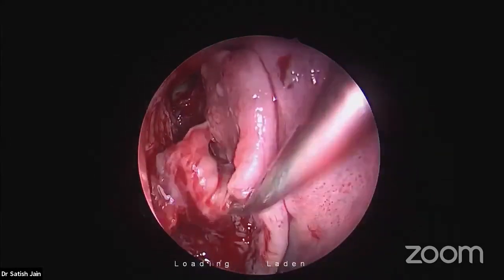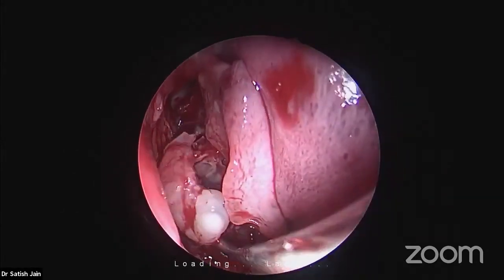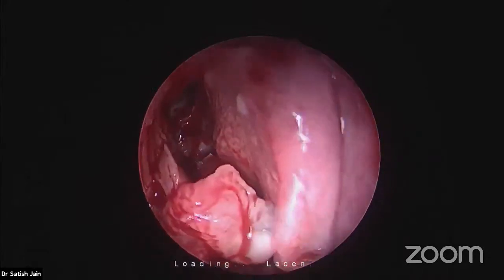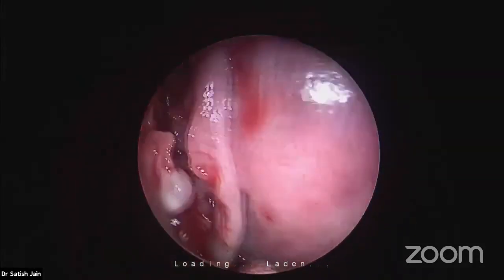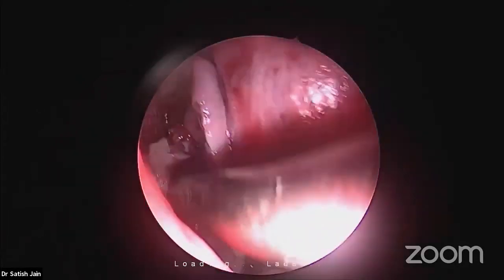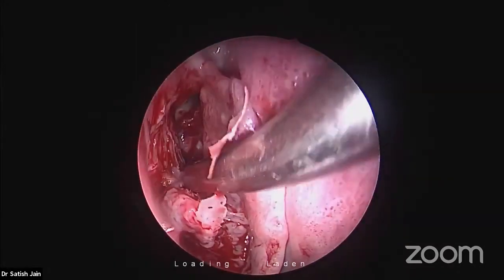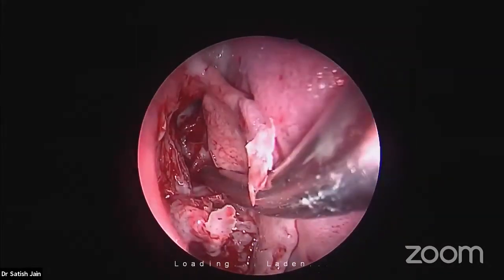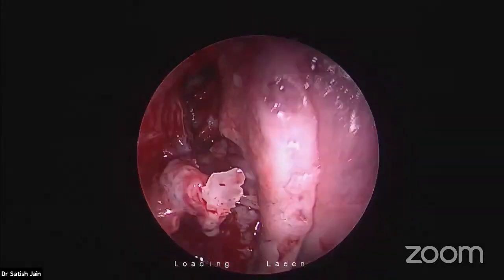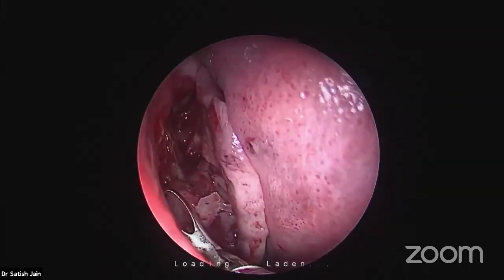And I can go behind and fracture the bulla completely anteriorly now. See, this bulla is completely fractured out now. Is it important to remove this space? The bulla removal, is it important, if the disease is only in the maxillary sinus? No, in isolated maxillary disease you don't need to do that. This is required in eosinophilic and massive disease requiring a complete surgery. Not in every case.